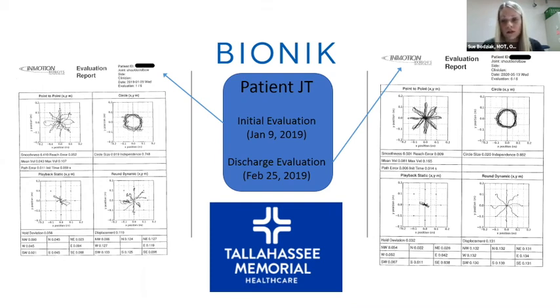I also print out the evaluation reports, and I will attach them either to the insurance, or we can actually upload them into our system and put them with the documentation as well. So really, it's really simple once you get the hang of it. Yeah, and I'll let Sheree address that too.